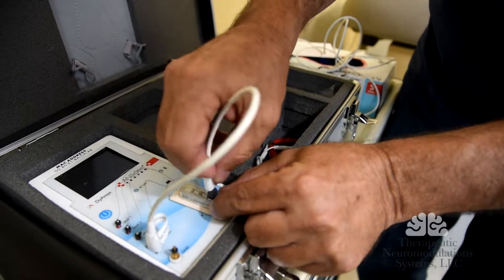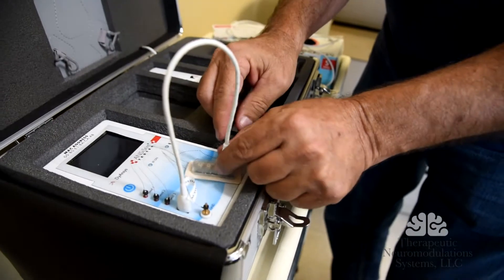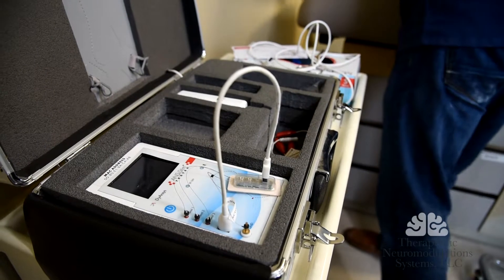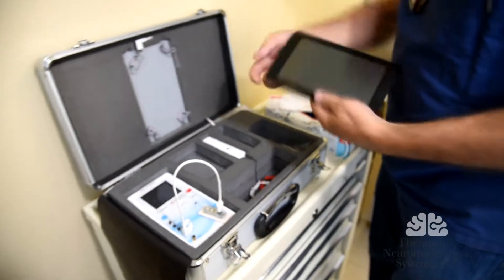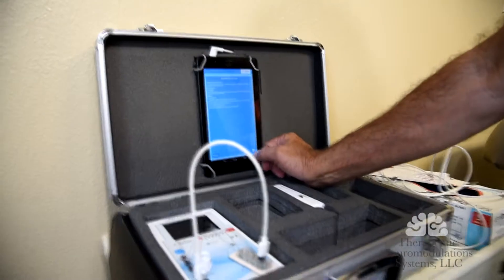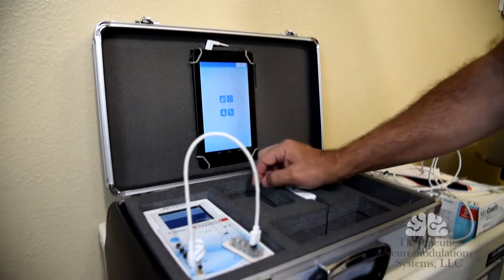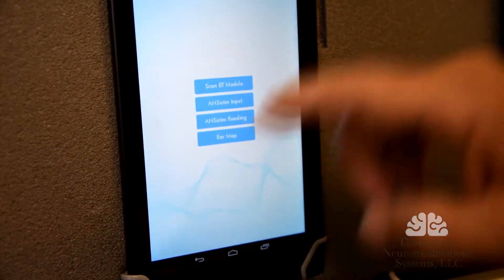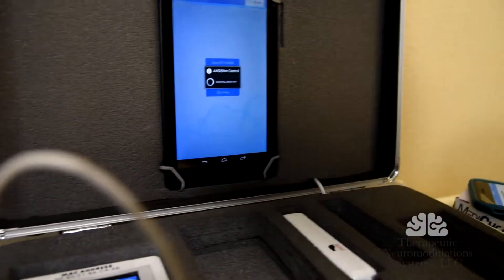Your energy goes up, all the pains you feel subside. It's all plugged in and it's ready to go. So I'm going to take the tablet, start the process. Make sure we have Wi-Fi. I'm going to go to the detox section.